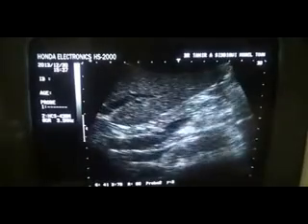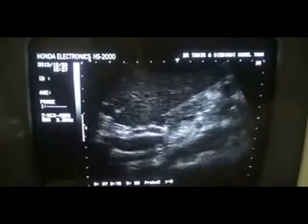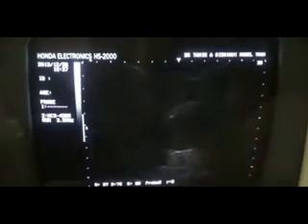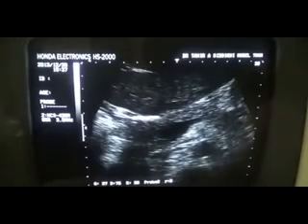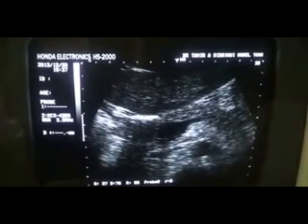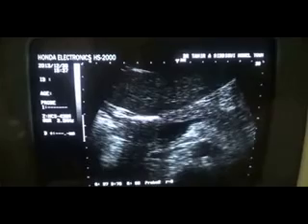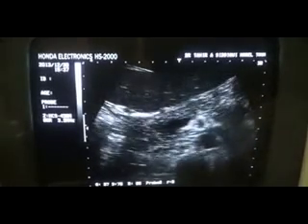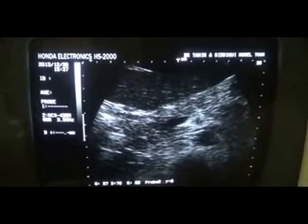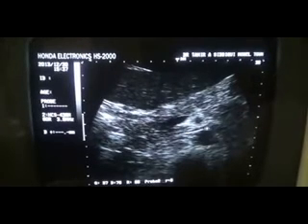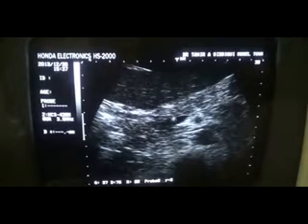Going to magnify a bit so it becomes clearer. This is the superior mesenteric artery and this is the tail of the pancreas. In this position, when I give a little pressure to the probe, this is the superior mesenteric artery with the echogenic border. This is the left renal vein crossing anterior to the aorta. This is the portosplenic confluence.